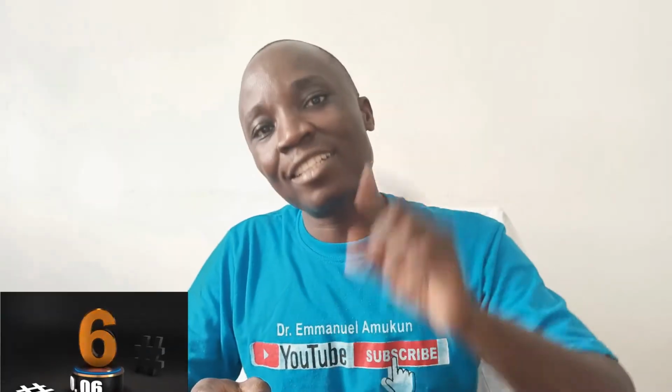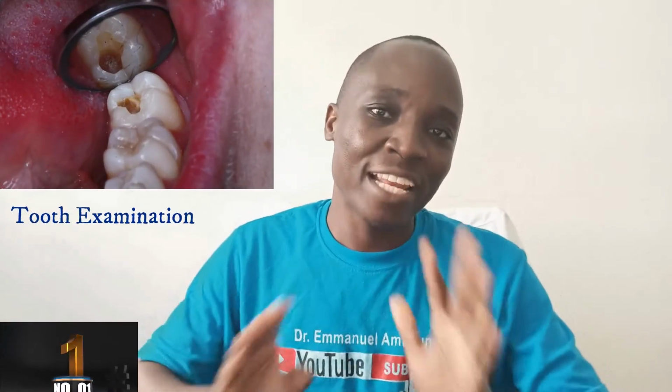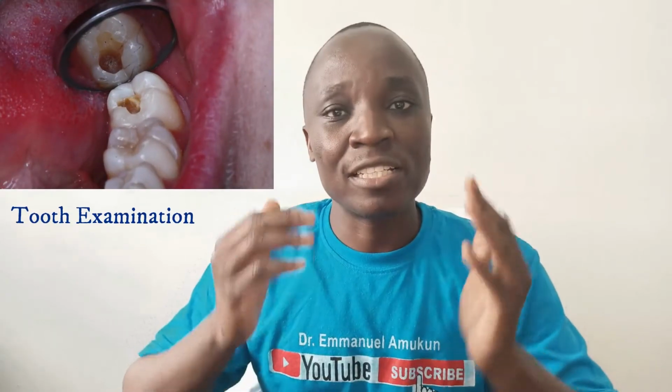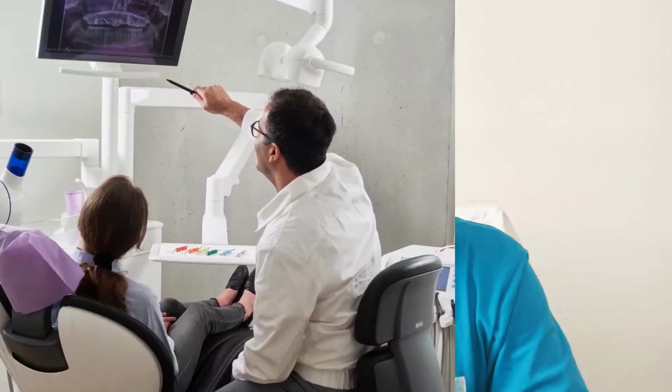So let's get into the actual root canal treatment process. Basically, there are 6 steps we take in the process of doing root canal treatment. The first step is to examine the tooth, just like we do with any other procedure. We first examine to establish the actual extent of the damage to the tooth. And we do this by physically examining the tooth. And then we can also take radiographs. So these x-rays can also help us to determine how far the damage has reached.